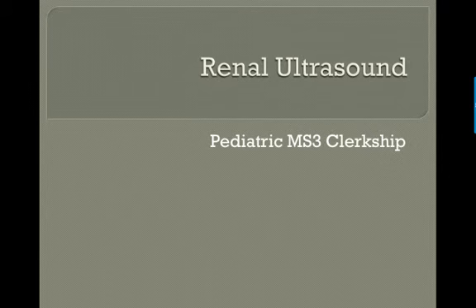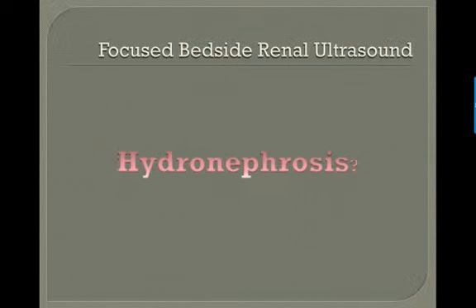Welcome to Renal Ultrasound. This is for the pediatric MS3 clerkship. We're going to go over some basics of pediatric renal ultrasound, as well as a few cases. In any focused bedside ultrasound, you're asking yourself a few particular questions, and in this case, we're asking one question: whether or not hydronephrosis is present.